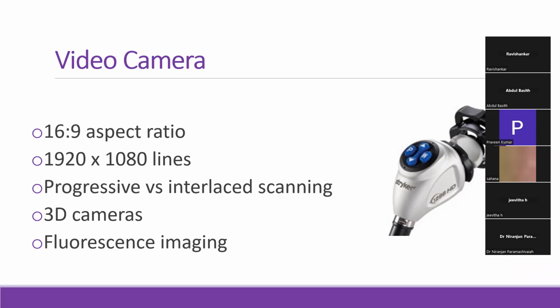Okay, the way the camera scans, every time it is scanning for the image once you switch on the camera, can be in one progressive left to right fashion, or it can be interlaced. The image or that area can be broken down into many vertical slits, and you can do it this way. Progressive is a good way of scanning that gives you better clarity than interlaced scanning.